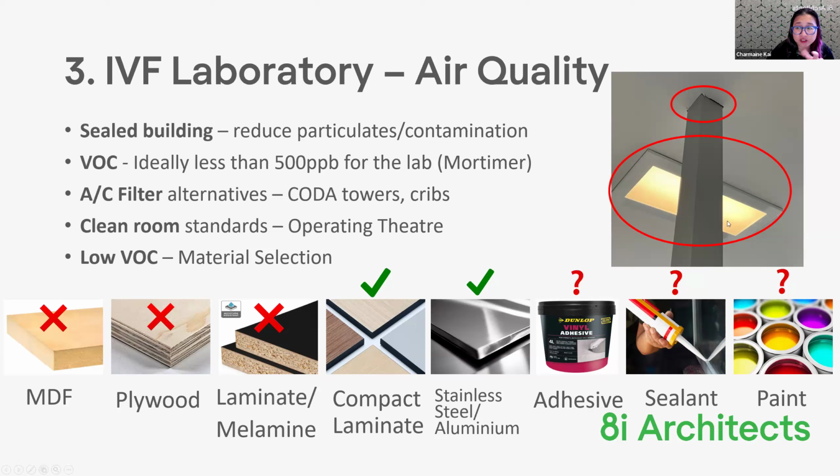And now if you're using LED lighting as well, the advantage of it is it has a really long lifespan, so you don't have to be pulling the lights out to change light bulbs as often, so you can actually seal these. So there's two areas that I see a lot of penetration for dust ingress and particulate ingress and contamination ingress. So make sure your labs are sealed spaces, and if they're not, run around with some silicone and seal those little spaces up.